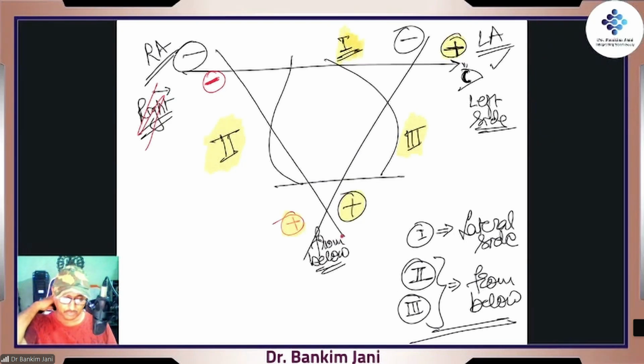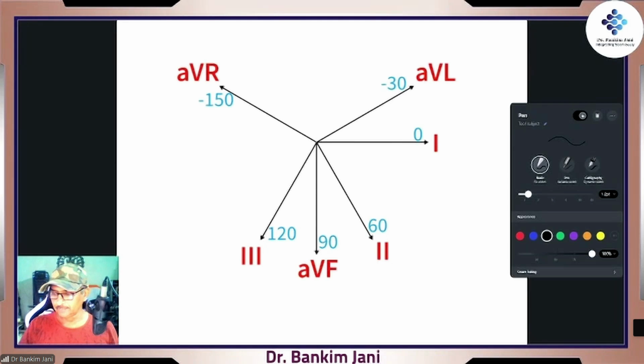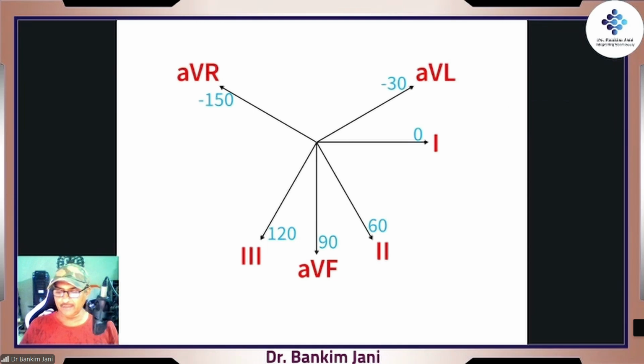If this is set, we go for now the not very difficult, but this is the portion which requires bit of your attention. But once you have understood, finish. All set. The most powerful system of the ECG learning is what is called as the Kabera system. Right? It's called as Kabera. But I'm taking you to that Kabera.